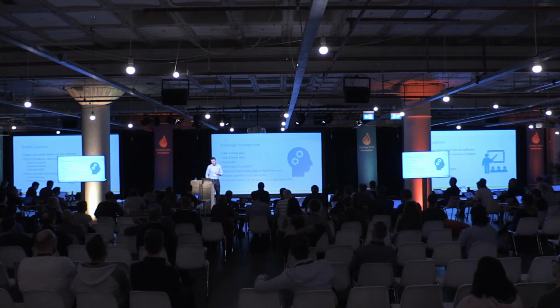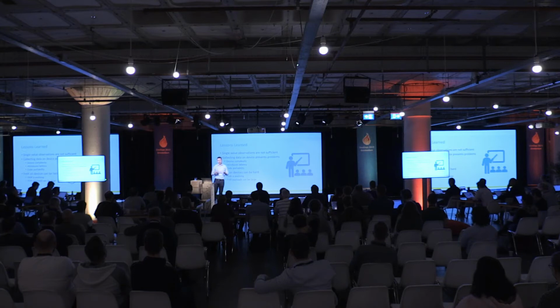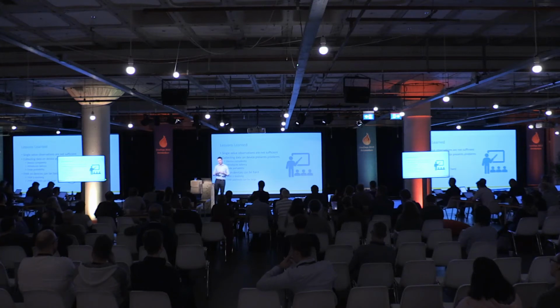which segues into some of the lessons learned as we were building out this pipeline. One, especially when you're dealing with high frequency data sets, a single value observation is not sufficient. If you're sampling once a second and creating single value observations, you're going to flood the medical record with observations quickly. And even if your FHIR server can keep up with curating those records, it's a pain to consume them on the back end.